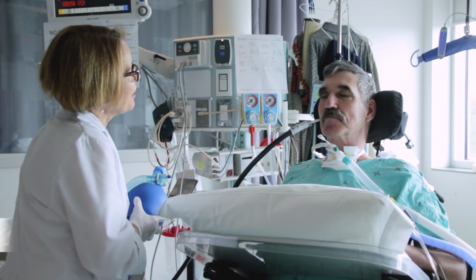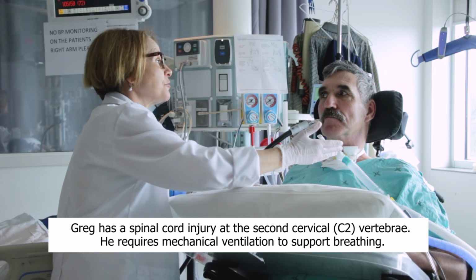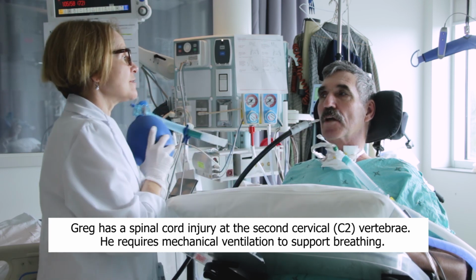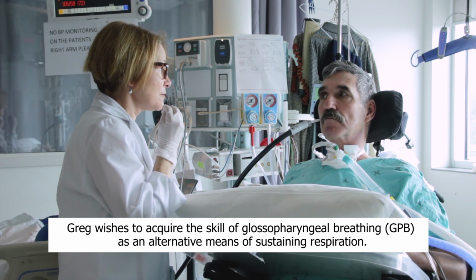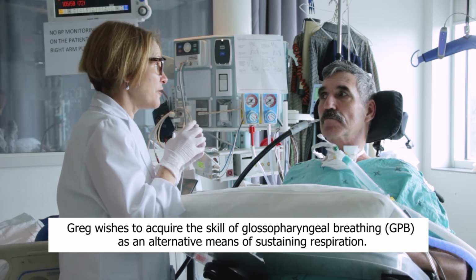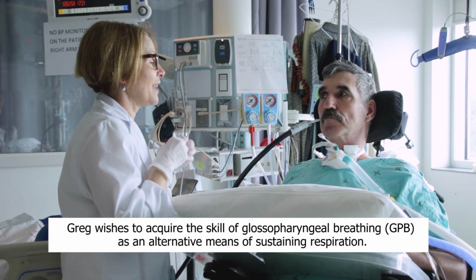We learn GPB by using supported breaths, either from the ventilator with the mouthpiece, or I can support the breath with the bag. You're using your throat muscles to move small boluses of air beyond your pharynx and push them into the lungs, right?